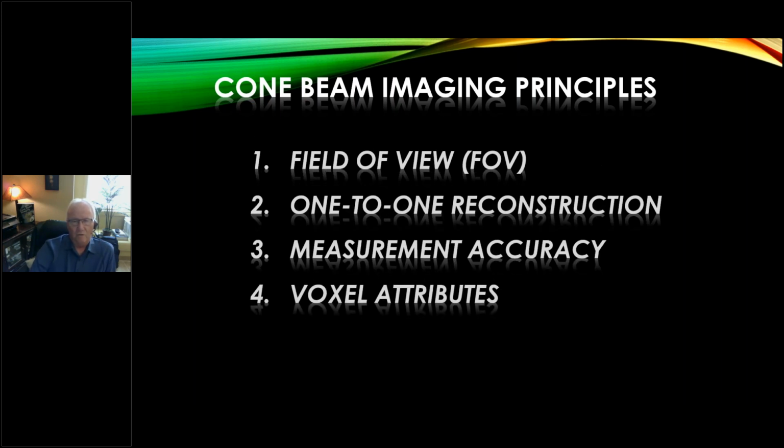So, a very rapid going over of some of the basics. Hopefully that will trigger your thought process as to why you can use cone beam CT for some tasks, but you may need conventional CT or medical CT or even MR for other things, especially with the temporomandibular joint and seeing soft tissue of the disc with MR.